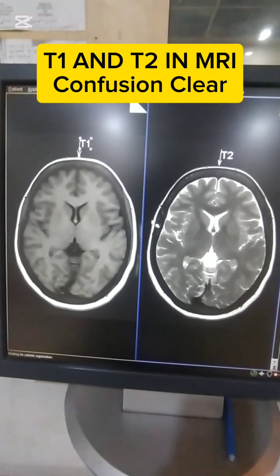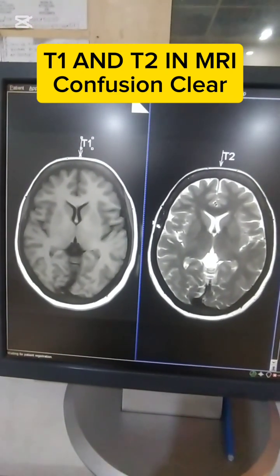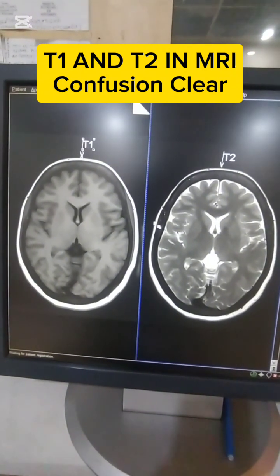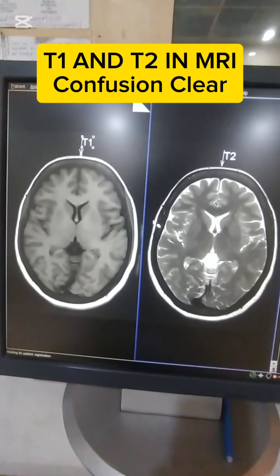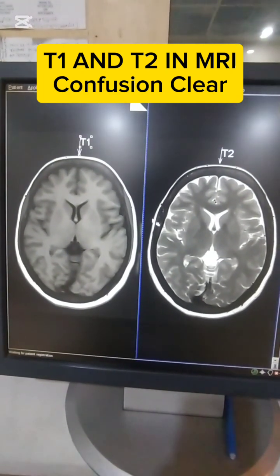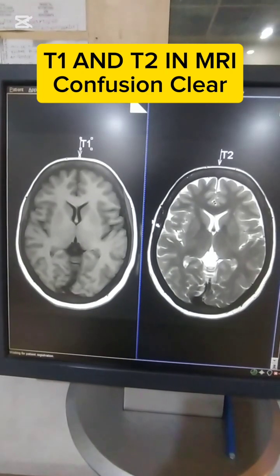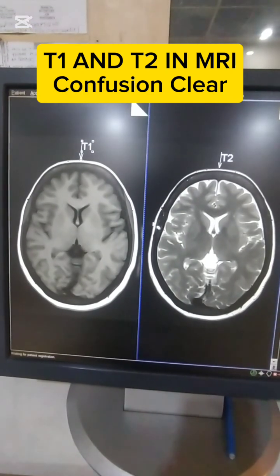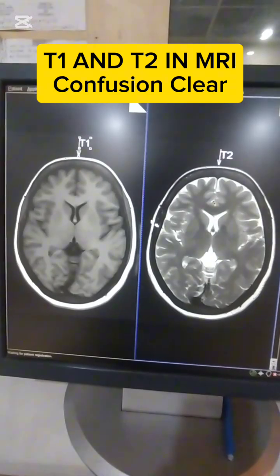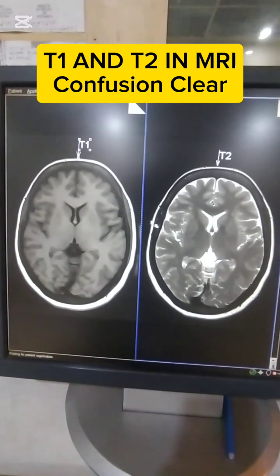And now T2: the time it takes for spinning protons to lose phase coherence among nuclei spinning perpendicular to the main magnetic field, that is T2 time.